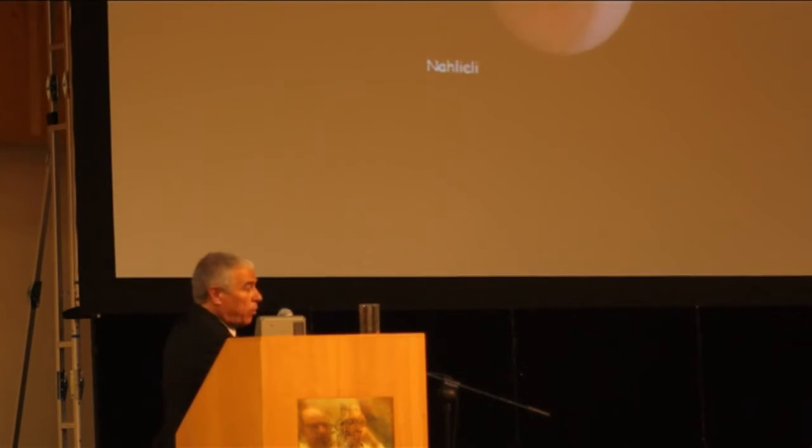With the basket, the problem is that you need to bypass the stone, otherwise you can get stuck inside the gland with the basket. And we need to bypass the stone, as you can see here.